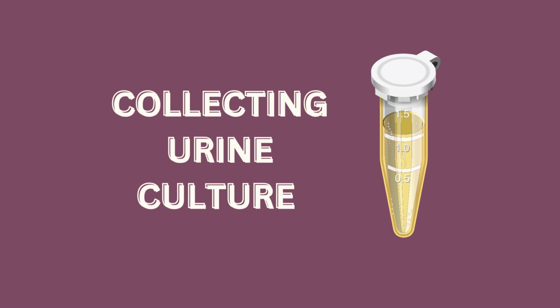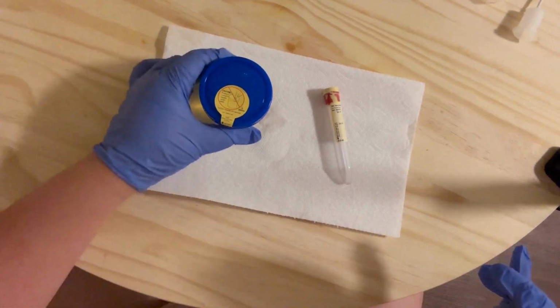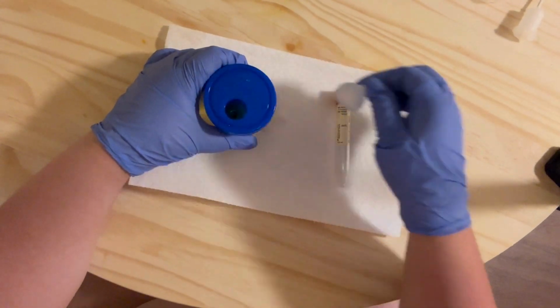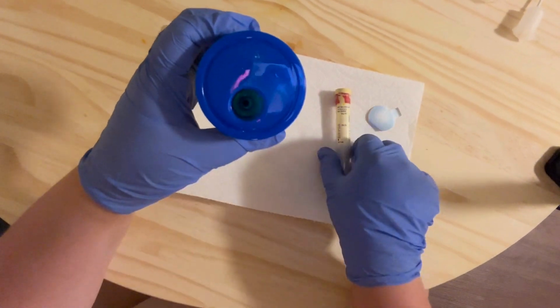In order to collect a urine sample for culture and growth, start to urinate, let some urine fall into the toilet, and then collect 1 to 2 ounces of the urine directly into the sterile container provided. Void the rest into the toilet. Do not allow the inside of the container to come into contact with the skin, and do not collect the urine from the toilet. The provided container is sanitized and prepared especially for your specimen. That's why it's sterile.